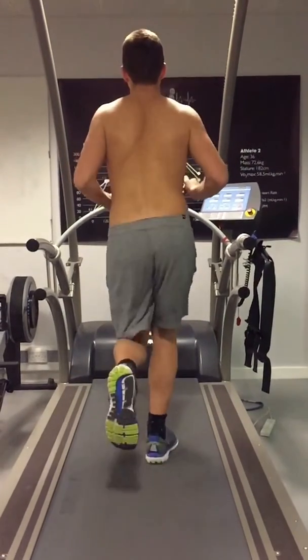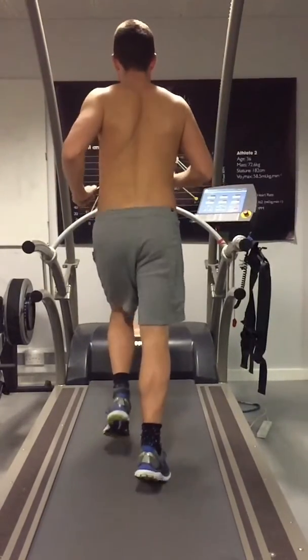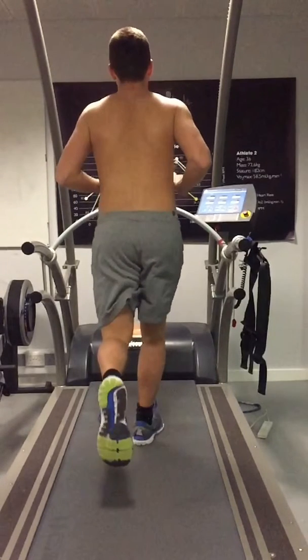This is a recent running analysis performed at the Performance Lab clinic. There are a number of biomechanical faults occurring, but we'll start off with looking at this runner's position of his hip and his pelvis. As you can see, when he initially makes foot contact on his right leg, his pelvis remains level. If we go on to measure the angle formed between his pelvis and the centre of his hip through to the centre of his leg, this angle is 86 degrees.